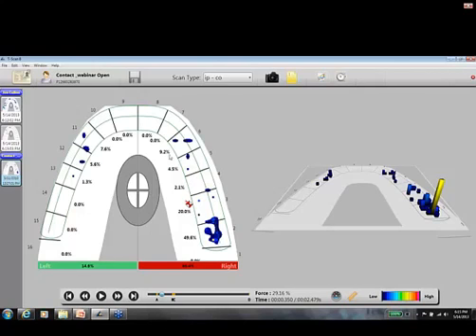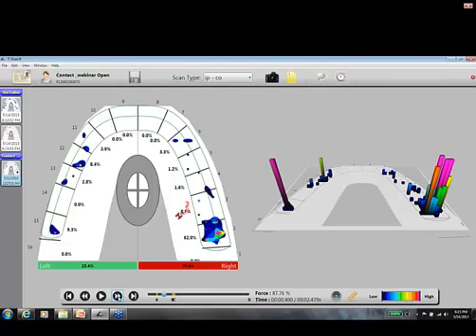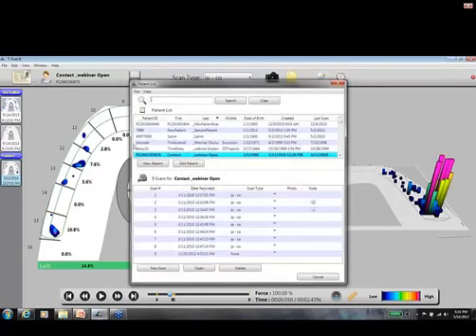We have 85% of the force on the right early on. This is the information that would be really valuable to know before you send your patient out the door, because he winds up contacting on all of his teeth, and the paper marks looked really good. But this is the information that's missing. So let's see. I'm going to go through and show you what we did.